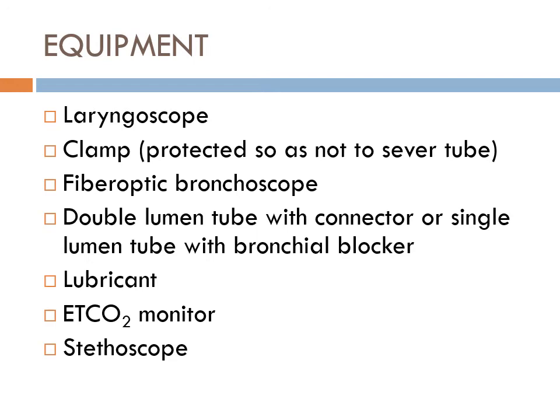All right, so here's my tube. It's sitting right below the vocal cords. Vocal cords, just so you guys have an idea. This is the vocal cords. Here's my tube. The cuff should be right below the vocal cords. Doesn't matter what kind of tube it is, it's all the same, coming out of the patient's mouth.